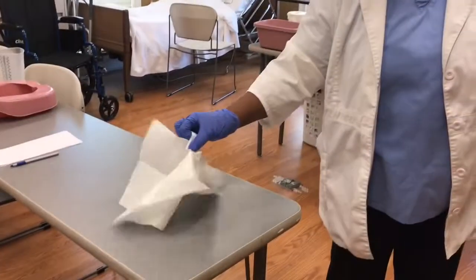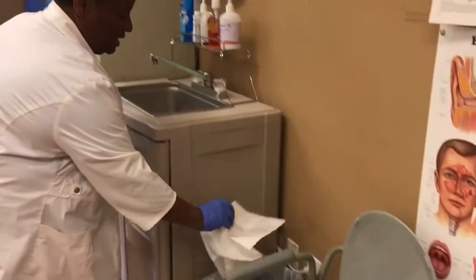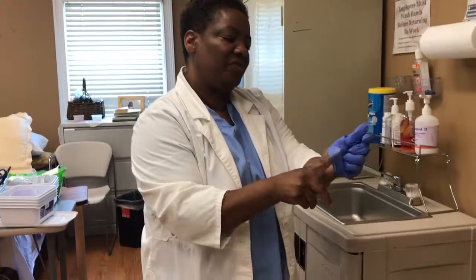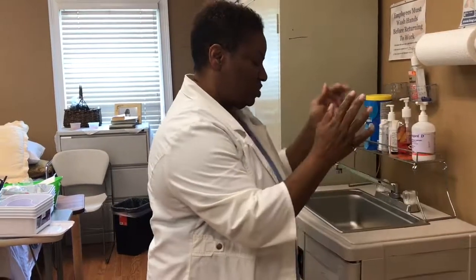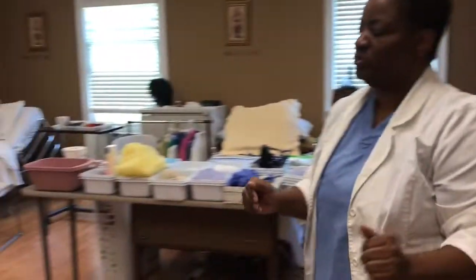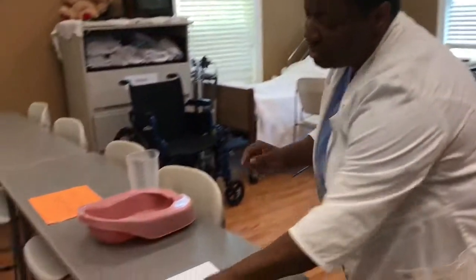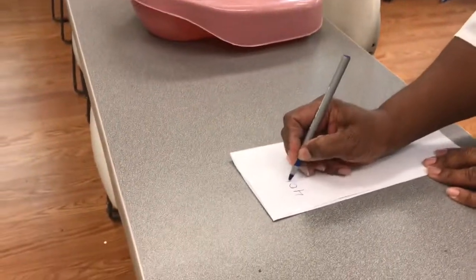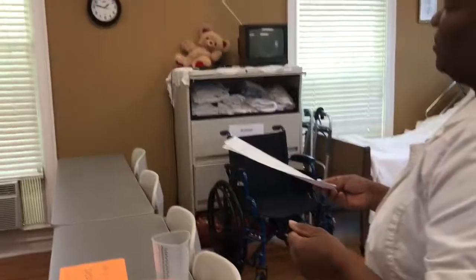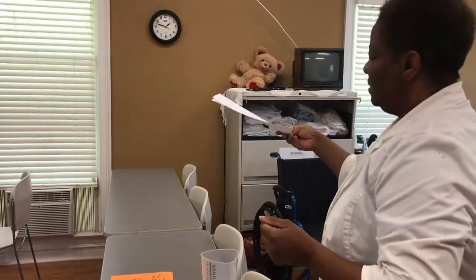I will take the barrier up and place it in the trash. I'm going to take my gloves off and put them in the trash, then wash my hands. I'm going to document my urinary output — 400 cc's, 400 ml's — and then I will give my urinary output to the examiner. I'm finished with that skill.